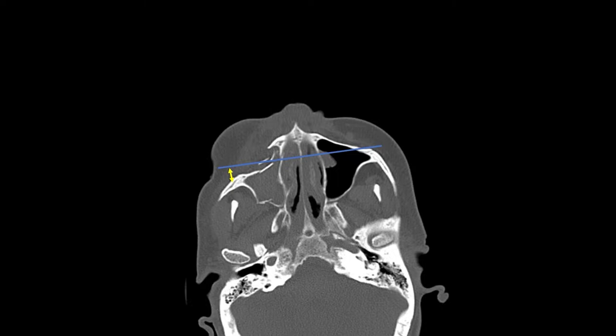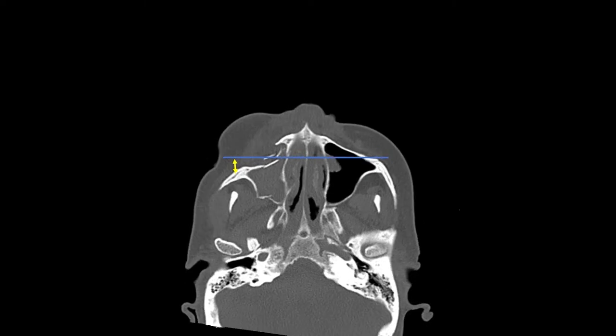Scrolling up higher, here you can see the malar eminence. I generally draw a straight line across the malar eminence. You can see that in this image, the axial slice was taken with the patient's head tilted — this is the reason why the line is tilted. However, you will want to generally draw a straight line across the malar eminence. You can see on the patient's right side, which is on the left side of the screen, the malar eminence is depressed about four millimeters.